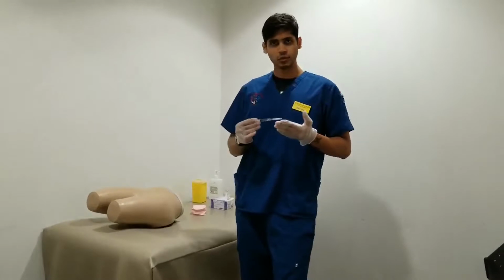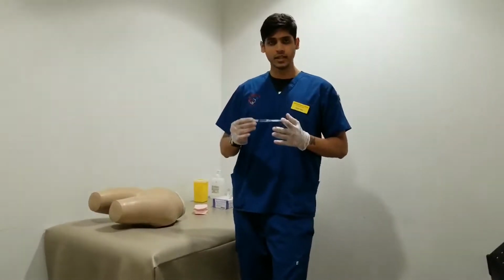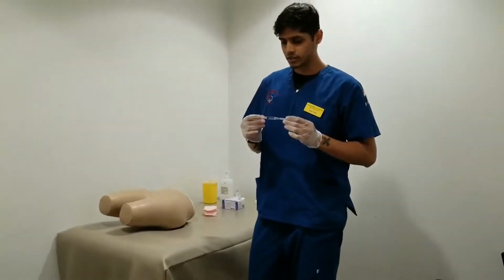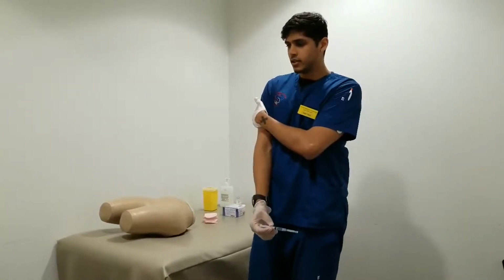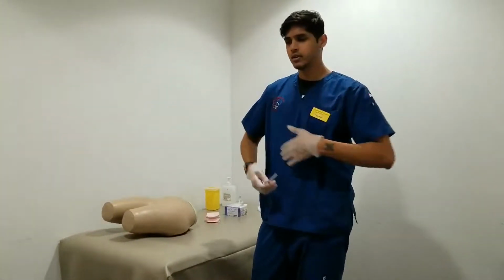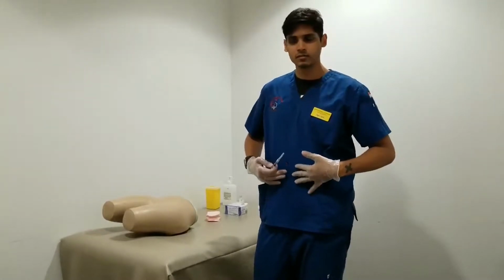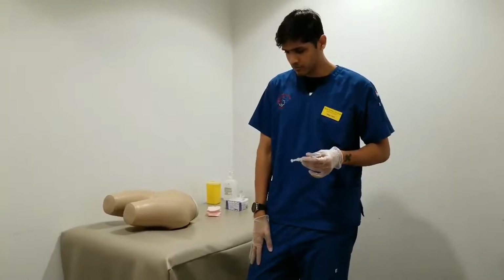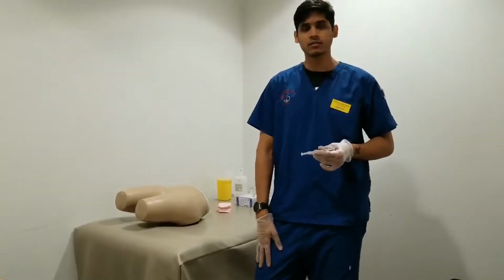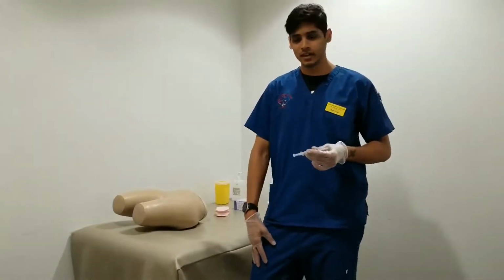Alright, so the first injection we're going to be giving is our subcutaneous injection. Our subcutaneous injection is normally given at 3 locations, preferably the outermost region of the arm, your abdomen area from the costal margin to the iliac crest, and the anterior portion of your thigh.